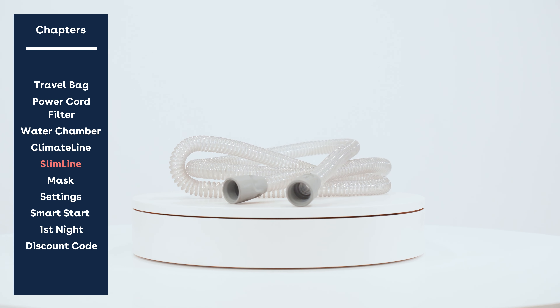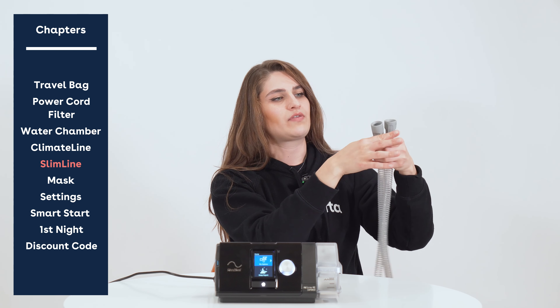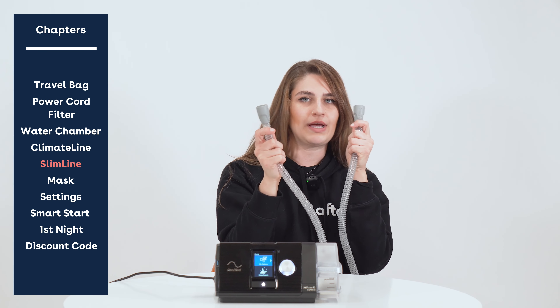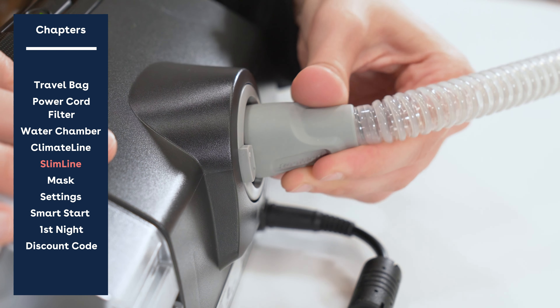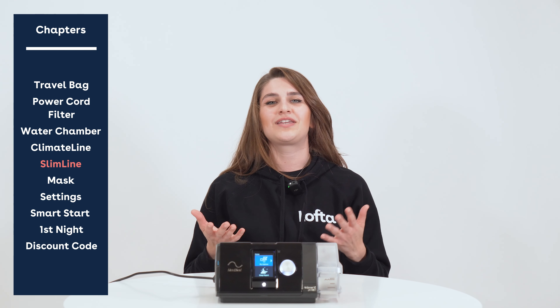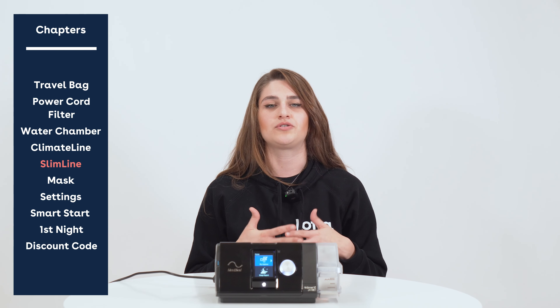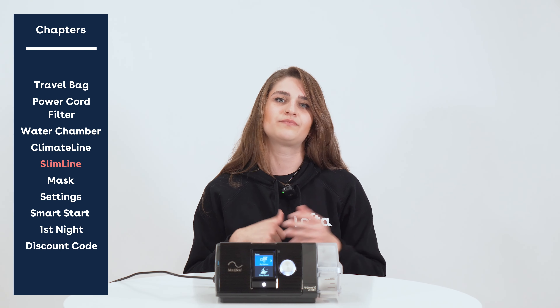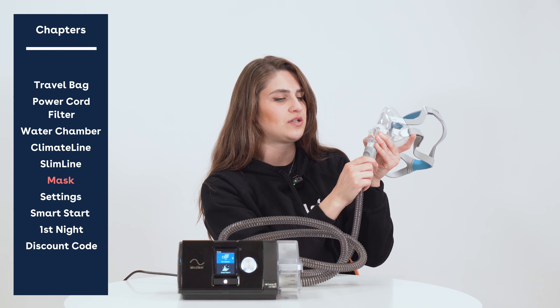This is your slimline tubing — it will be pretty clear or white, and the ends are exactly the same so it doesn't matter which side you put your mask on or which side you insert into the device. It inserts into the back of the unit without an adapter, but it won't swivel, so keep that in mind. If you didn't get the heated tubing this time, don't worry — we recommend changing out your tubing every six months regardless, so you can get the heated version next time. Connect the other end of your tubing simply to your mask.